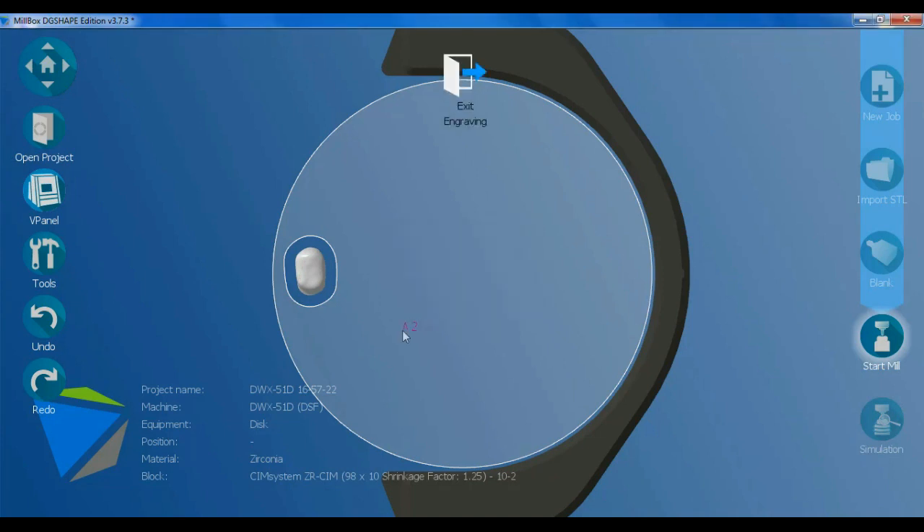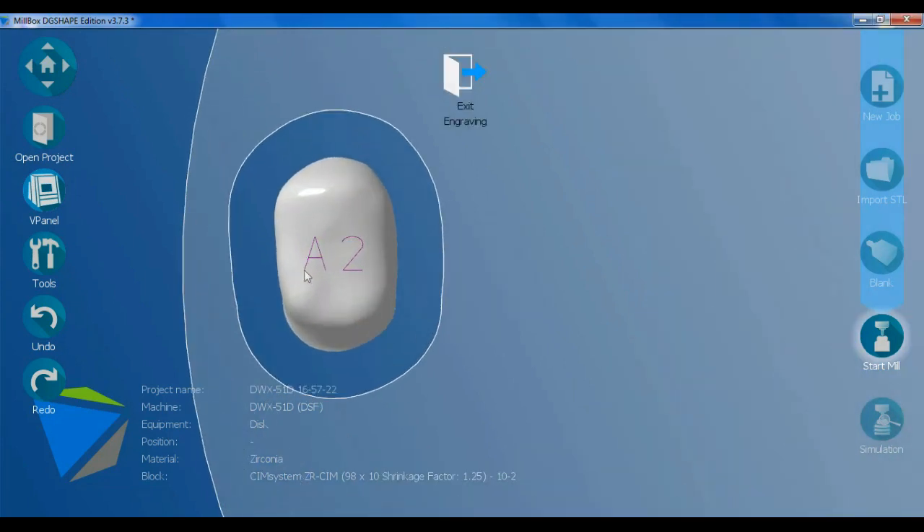Hold the Ctrl button on the keyboard and use the mouse scroll to rotate the mark. Hold the Shift button on the keyboard and use the mouse scroll to resize it.